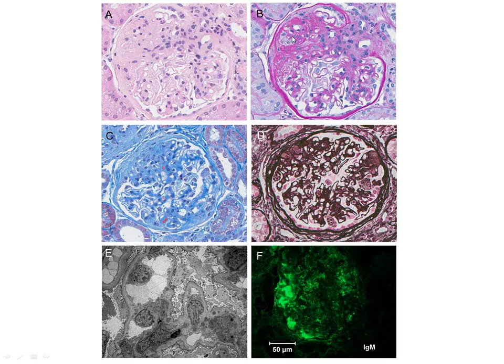Yep, please. So the question for everybody on the computer is, how do we know this is hyaline, because it looks the same color as the glomerular basement membrane? And honestly, this is just shape. If it looks globular, then it's hyaline, and it will be that same kind of color.